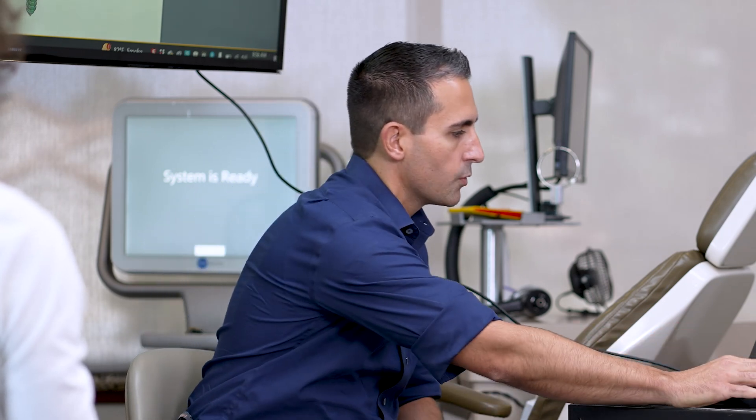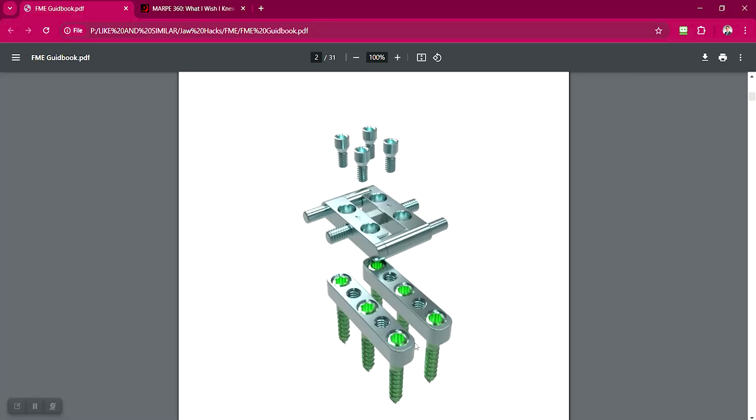Are the FME TADs different than the custom Marpy TADs or the MSE TADs? They are different because they have their own proprietary TAD, and the most unique thing about them is the locking mechanism of the TAD and how that secures to the anchor body. You can see that the TAD goes all the way down into the anchor body.